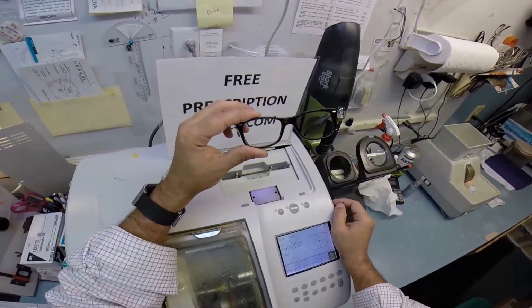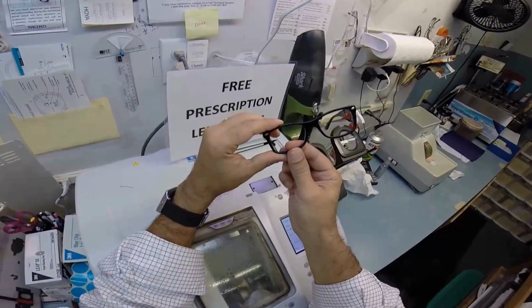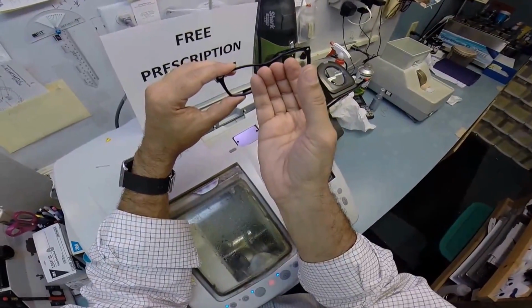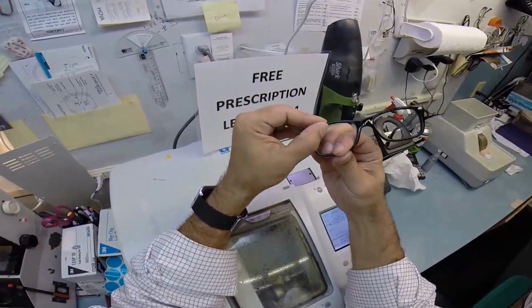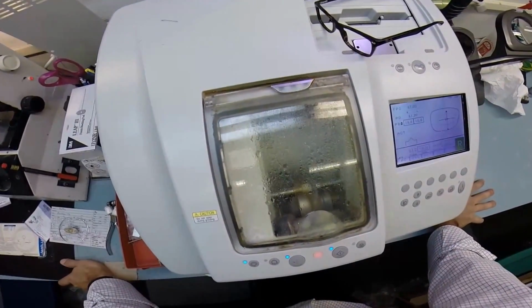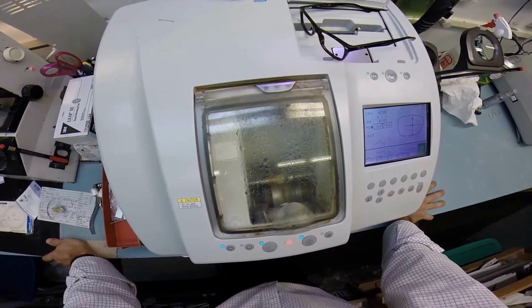The reason why I don't want to force it is if it's too large, it will cause your frame to stretch, or as we also say in the business, roll. If you can imagine your frame, that bevel is a gutter on your house. If it's too large, it's going to cause the frame to roll, and eventually over time that looks terrible. And since I'm a one-man operation and I cut every lens before it goes out the door, you want a perfectionist like me cutting your lenses so they fit in there perfectly.